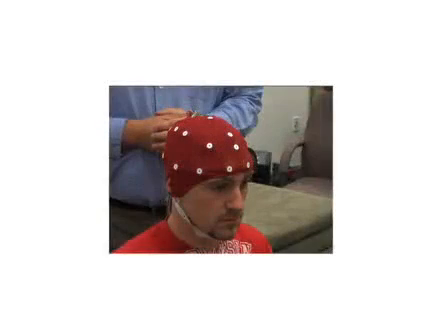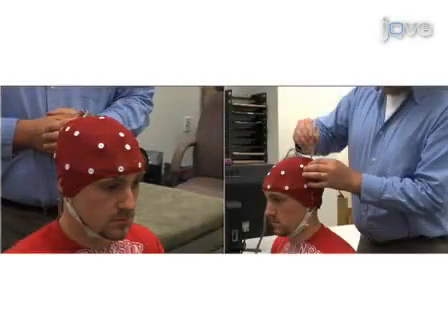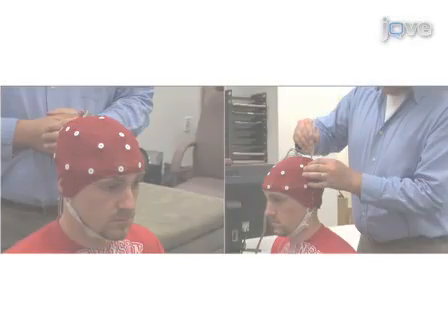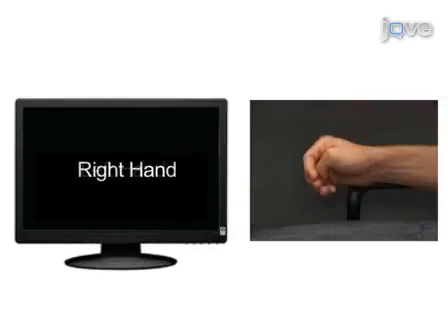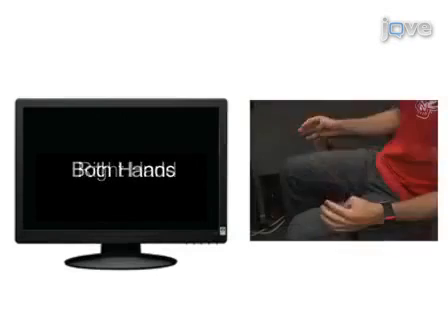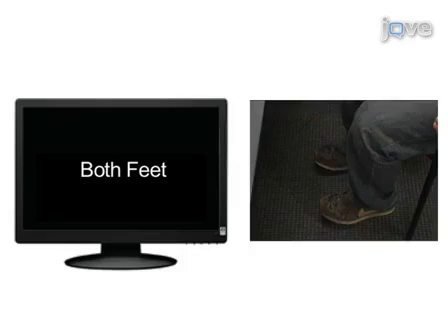The procedure begins by attaching the EEG electrode cap to the subject's scalp to record brain activity. The subject is then asked to imagine several voluntary movements with their hands and feet, at which time a calibration procedure is performed which analyses the characteristics of the EEG.